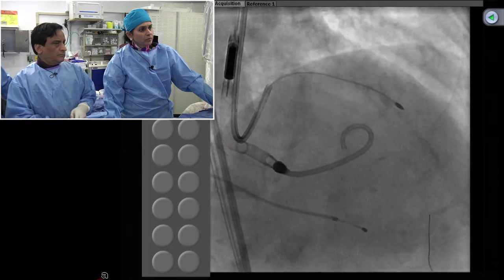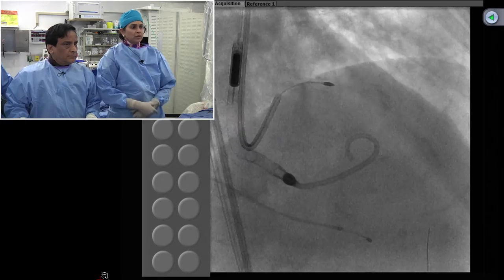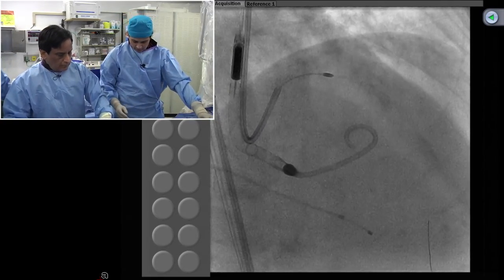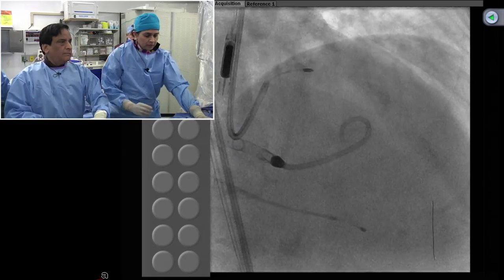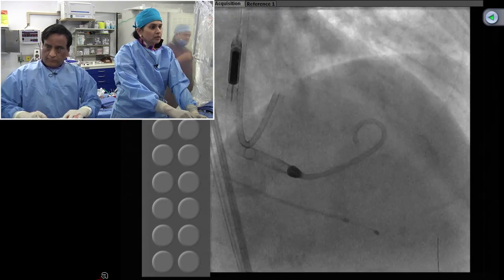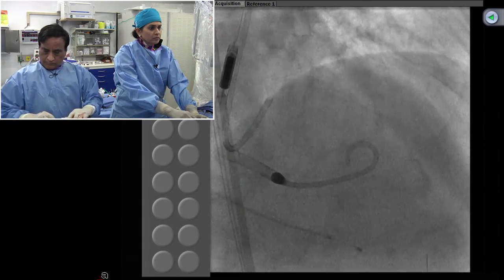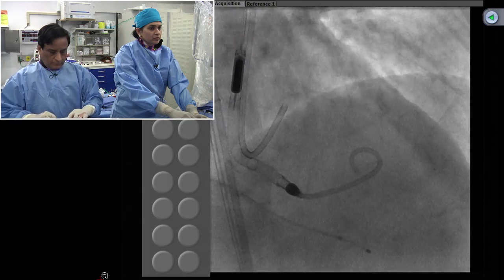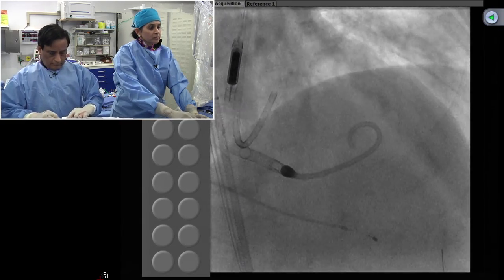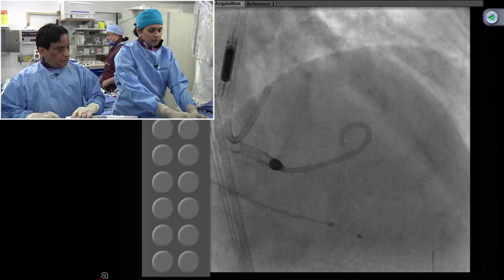Preventing the jumping and doing these polishing runs back and forth to show no friction with any plaque — you see the smoothness of the passageway. I'm not sure the IVUS would have gone down at the 1.5, probably not. But I was trying to be academic — I didn't ask for FFR either, so you can't feel that I'm very unhappy about it.